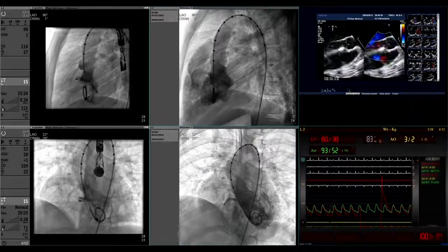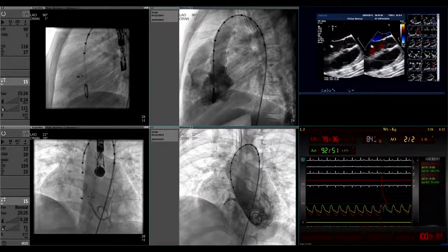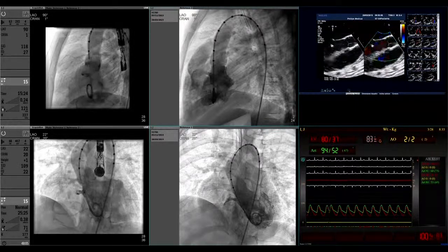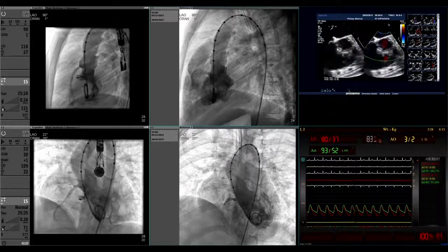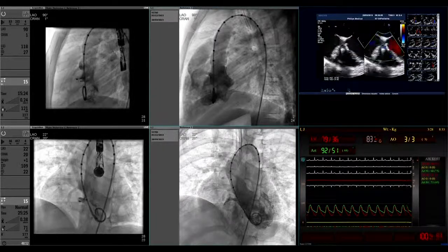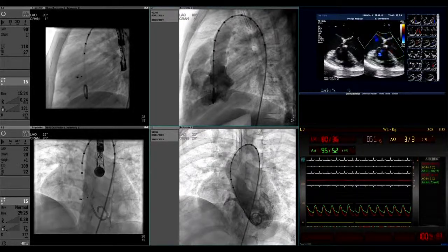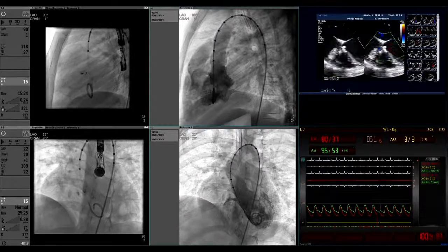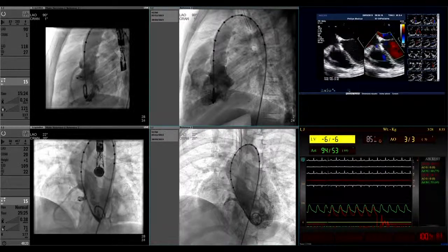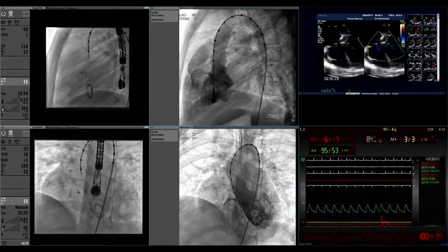Yeah, you see the left side of the device does not touch the aortic valve. And the device is inside the total length of the defect. I think it's good, almost no residual shunt. Yeah. Can you check the tricuspid valve? I saw before some tricuspid valve regurgitation, now it has almost disappeared. Perfect. Okay. And any comments? No, it's just perfect. Congrats. It looks very good, guys.